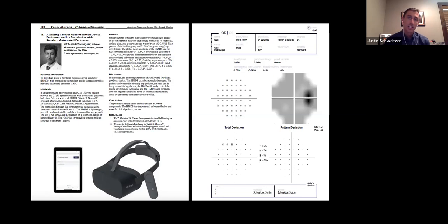The other motivation is just to remind them that this is a crucial test for us to monitor or pay attention to something that is visually threatening. You can lose your sight from this, and we're doing everything we can to prevent that. This test is just crucial to have that done. And so those are probably a few of the things that I would mention.